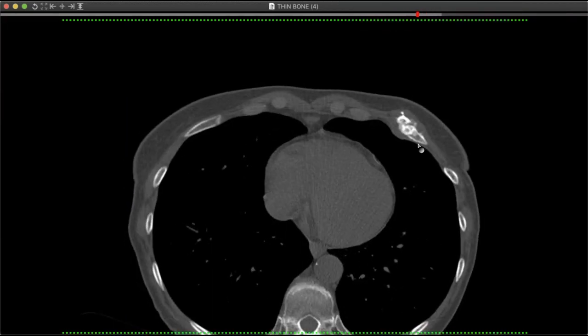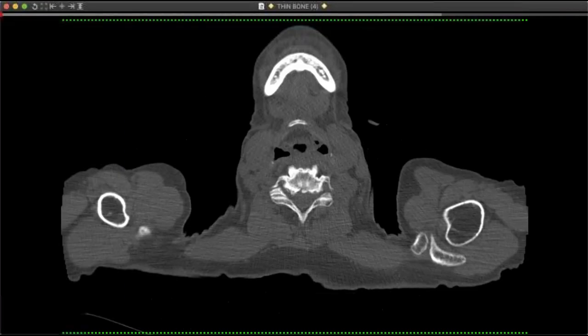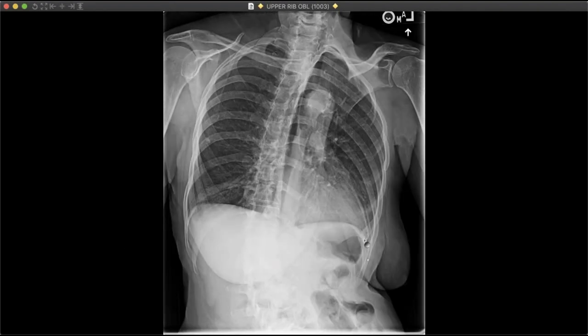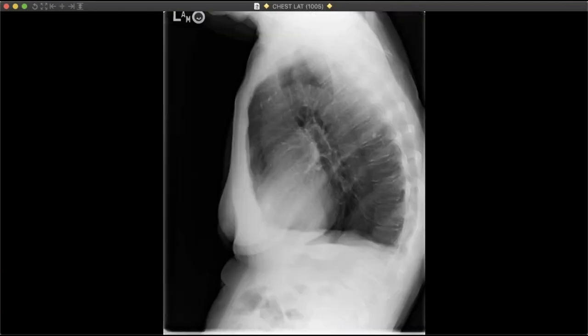And the patient's a good age for it. I think it was 50 or 60? I can't remember. Here, I'll go back. It was a 65 year old. But in retrospect, I found some old outside imaging, and you can see on this rib series, and this was about a year before, there's this little sclerotic thing at that rib on the oblique. It's right there, and the lateral I don't think added very much, but I did find an old CT from the outside.